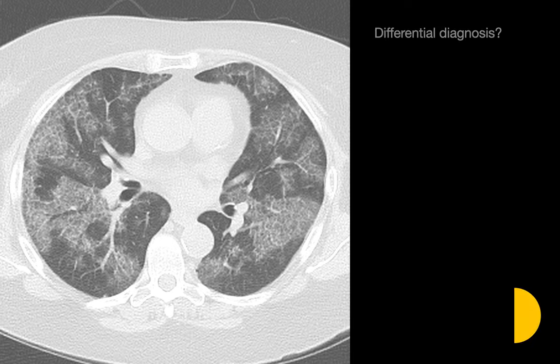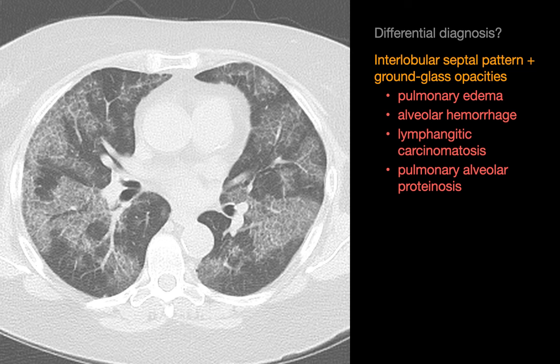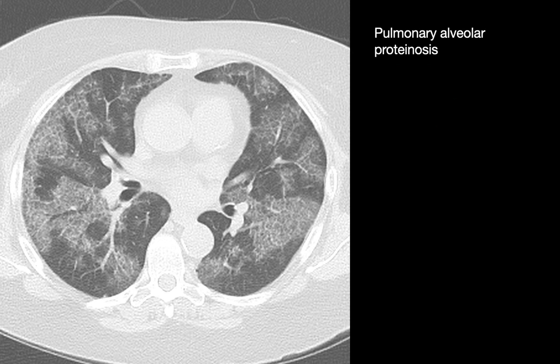What's your differential diagnosis for this case? The imaging features are very similar to the first case: an extensive, multifocal, bilateral, heterogeneous lung opacity pattern with both an interlobular septal pattern and ground glass opacities. In the first case, the septal pattern predominated, while here the two patterns exist in relatively equal amounts. As ground glass opacities can occur in any disorder in our differential for interlobular septal pattern, our differential is derived from those causes. This case is also an example of pulmonary alveolar proteinosis.